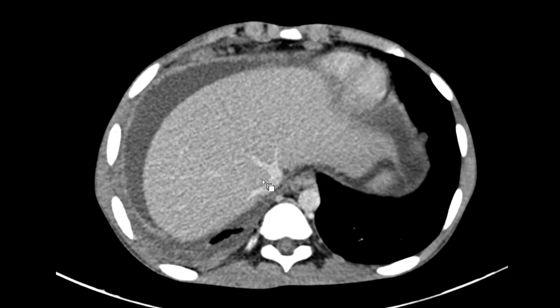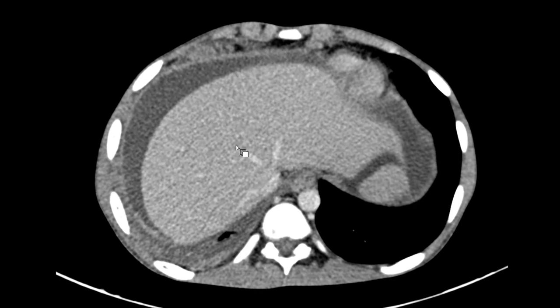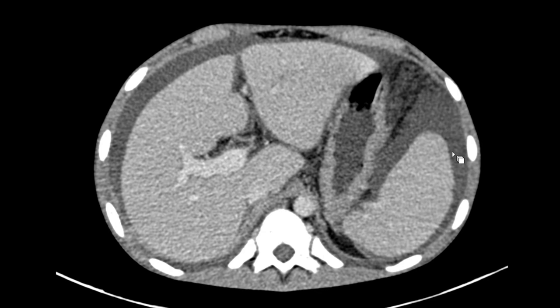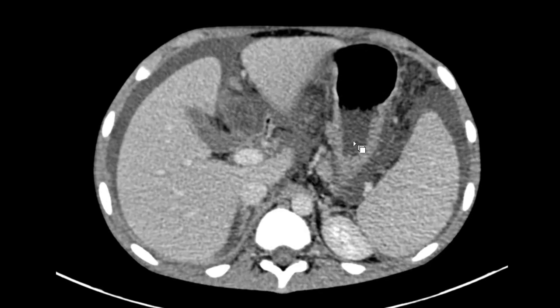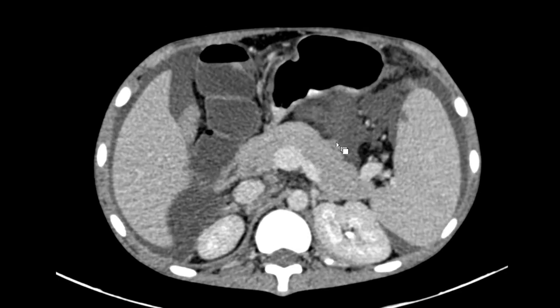So basically this is the intrahepatic IVC, which has given the middle hepatic vein, left hepatic vein, and the right hepatic vein. So the middle hepatic vein will first of all divide the liver into the right part and the left lobe. And here in this patient, the patient is having tuberculosis, so we are finding perihepatic fluid as a part of ascites only. And in this patient, perisplenic fluid is also there. This is stomach, and all around the abdominal organs fluid is there. That is, generalized ascites is there because the patient is having tuberculosis.